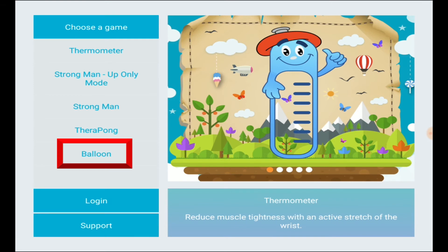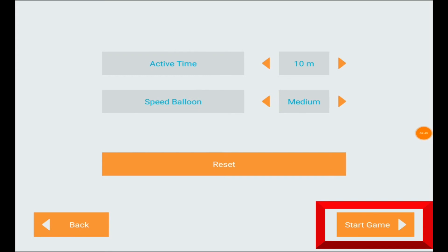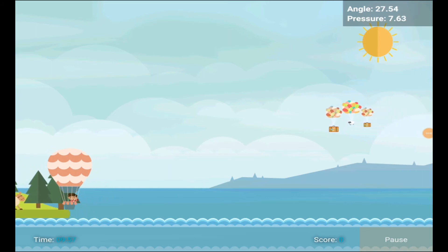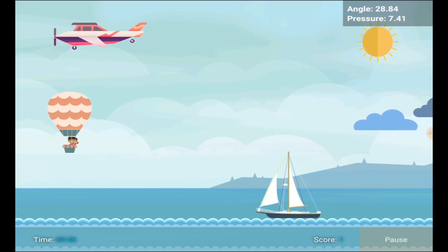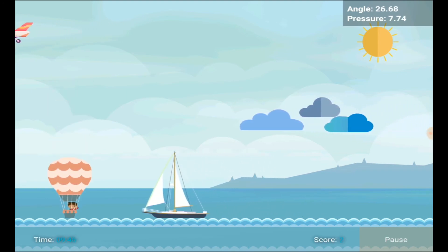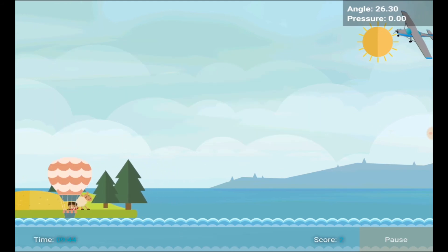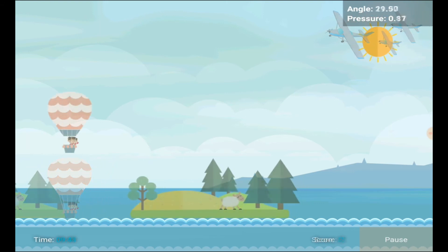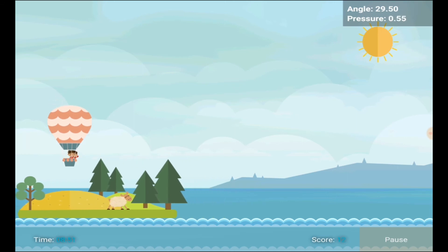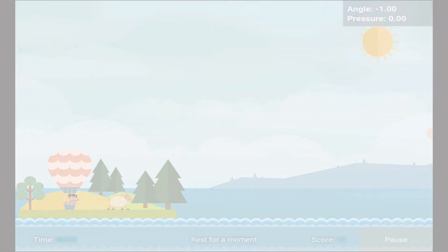Finally, we're going to play the balloon game. Select balloon from the game selection menu and hit next and start on the bottom right. Your goal is to avoid the obstacles coming at you by moving your hand up and down to move the balloon. Obstacles can be airplanes, clouds, or boats — if you hit one, you'll start again. Periodically, you'll reach a small island where you'll rest before continuing. Once you've completed your last exercise, you'll be returned to the game selection menu.